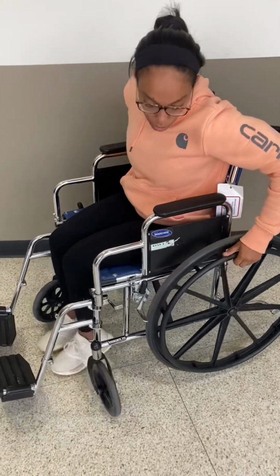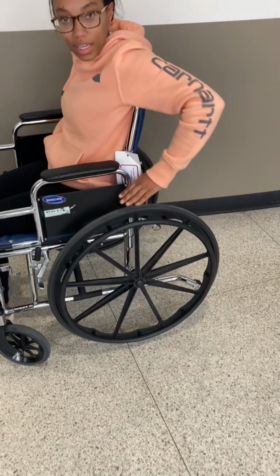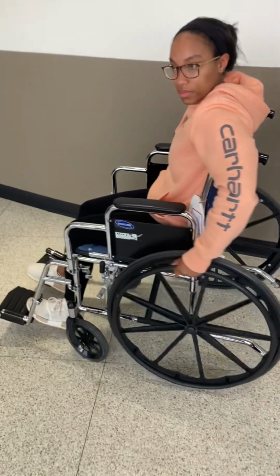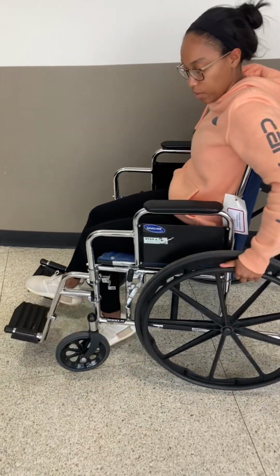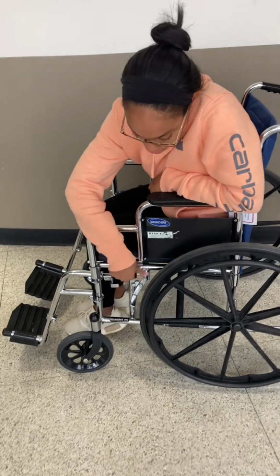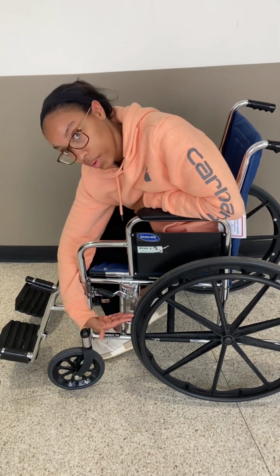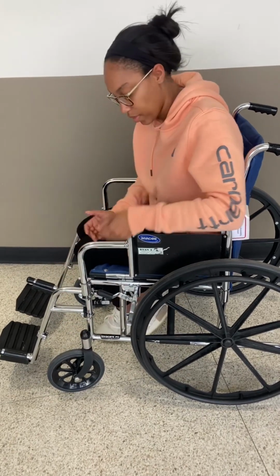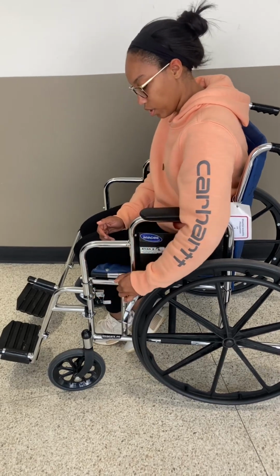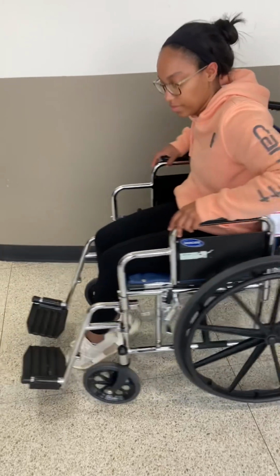And when it comes to the wheels, you want to only touch the big ones, touch at the rim and not the actual wheel part. So you're just going to hold the rim and move. And when you're trying to just stay in place and not go anywhere, you're going to push this knob forward so that the metal part goes into the wheel and you can't go anywhere. And then to unlock, you're going to pull the knob towards the wheel so it's not on the wheel anymore and you can move around.